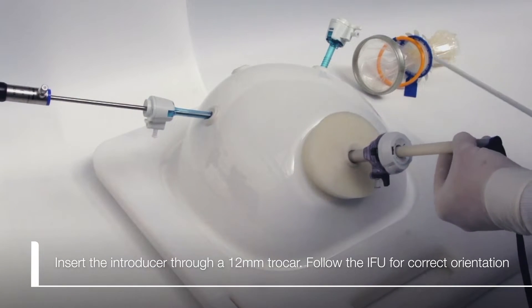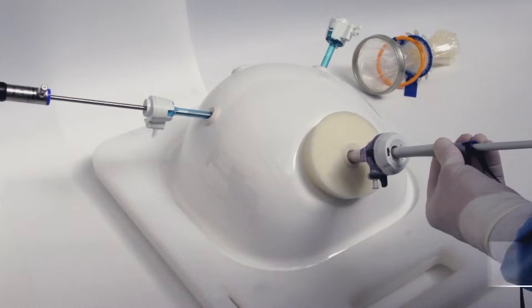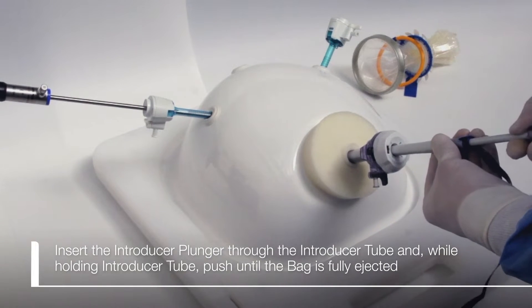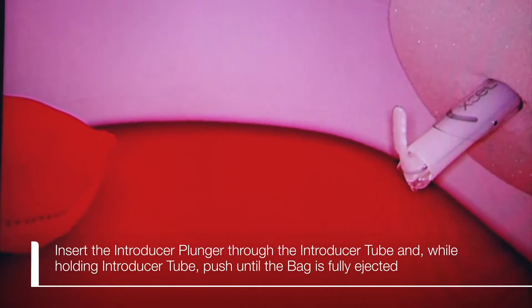Insert the introducer through a 12 millimeter trocar. Insert the introducer plunger through the introducer tube, and while holding the introducer tube, push until the bag is fully ejected.